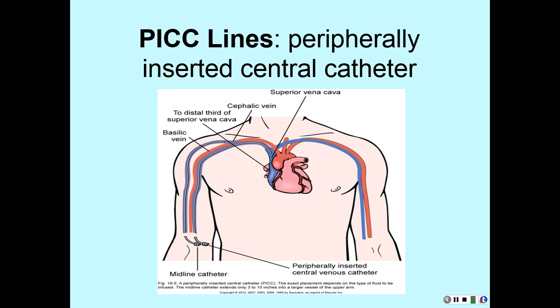These are fantastic for people who just have no veins. Some people just get a PICC line because you can't get an IV any other way. Yes, ma'am. Yes, if you do it at bedside, they have to go to x-ray to make sure that they're where they're supposed to be.